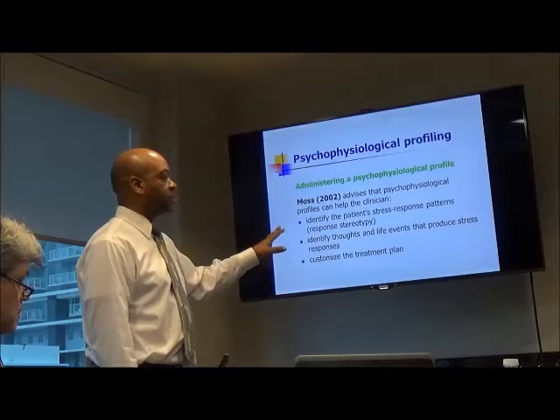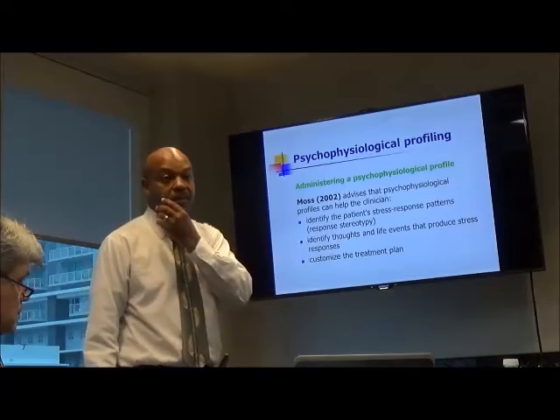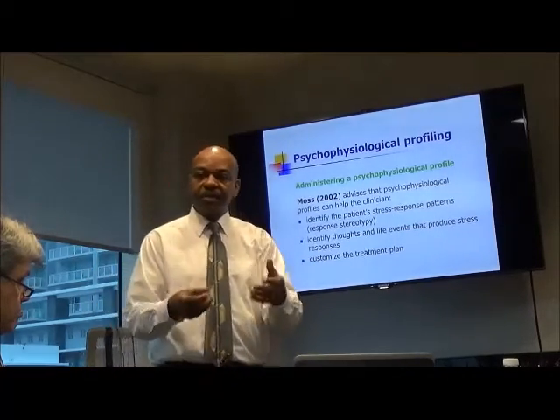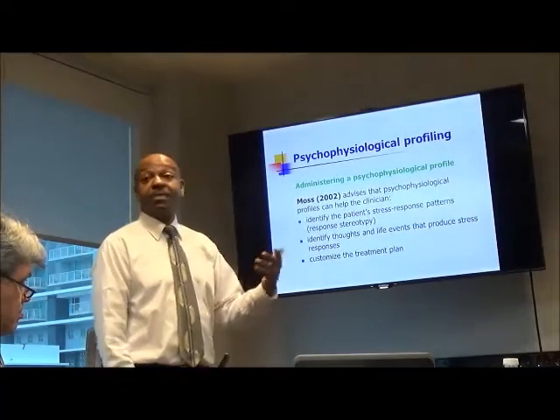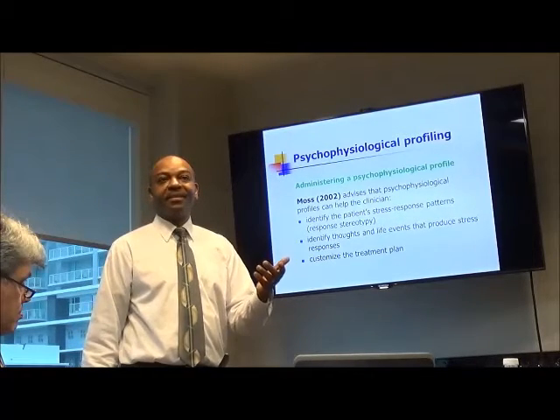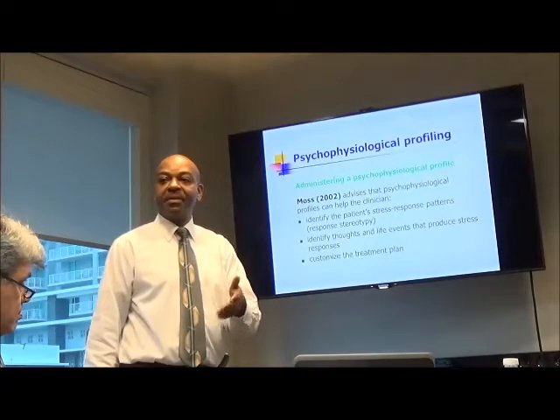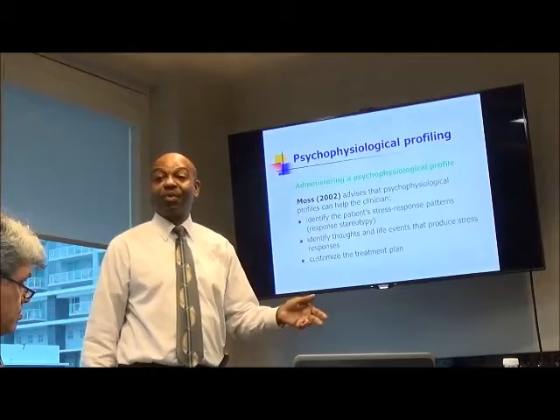So the stress response pattern can be individual. And that's part of the reason why we're doing this. If we just go to the textbook and see what the protocol is, we don't get that. Sometimes I'm very surprised, where I would think that the biggest thing I should work on with this particular person is EMG, but then I see their skin conductance. It looks like it needs more work than the EMG.